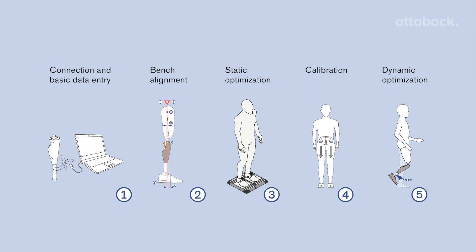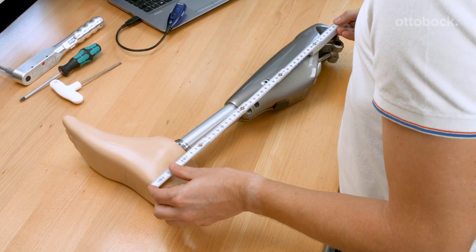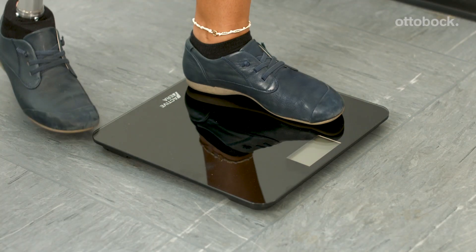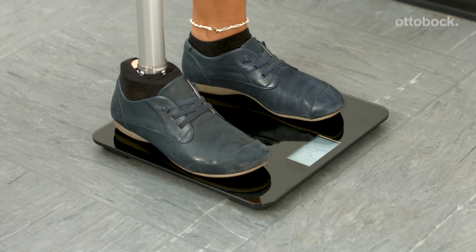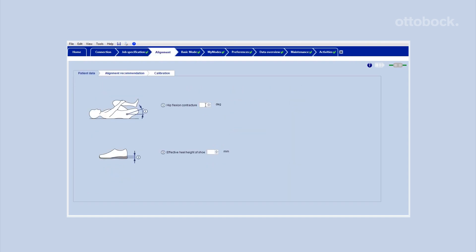Follow the recommended alignment and setup process for the C-Leg 4 to achieve the best result for your user. To ensure that the C-Leg 4 will release into swing phase, measure the knee center to floor distance without shoe and the body weight with prosthesis. Enter those values and all additional user data into C-Soft Plus.